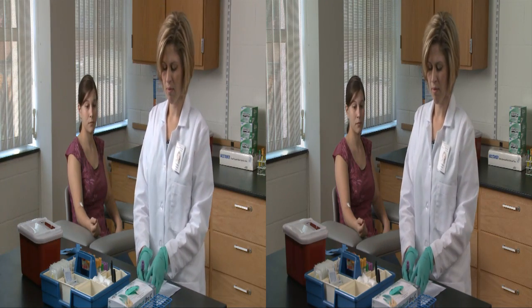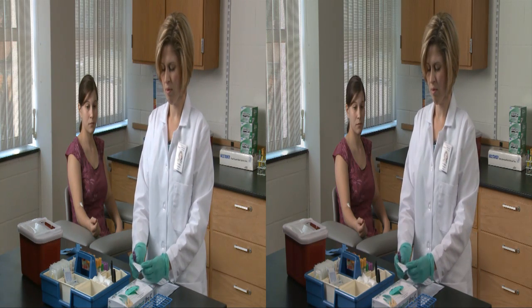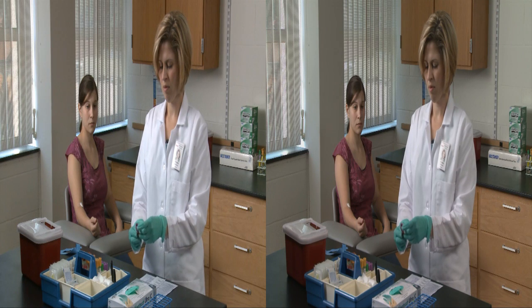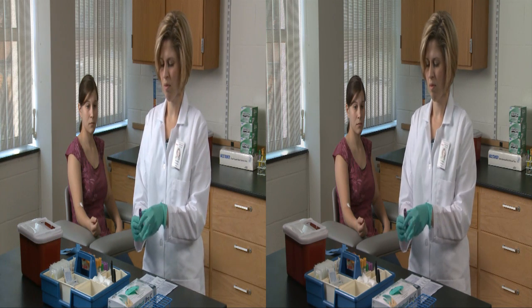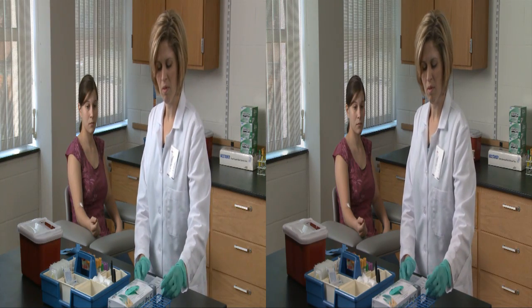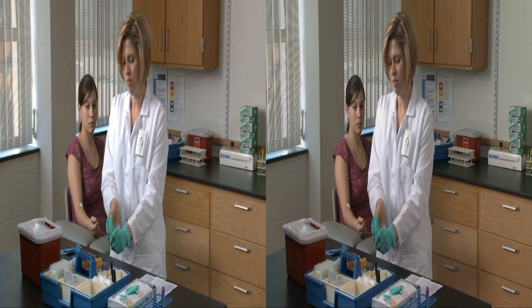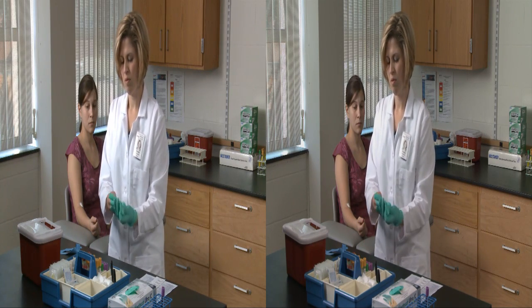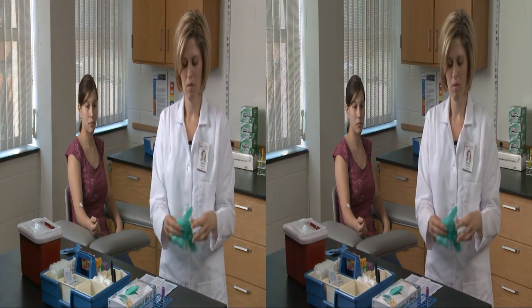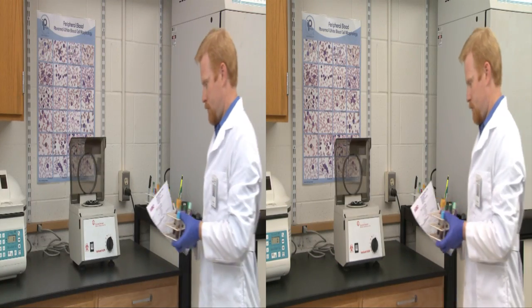Apply the ID label on the filled evacuation tube and store it for transport to the lab. The label must include at least the patient's ID number, full name, date of birth, and today's date. Using standard precautions, dispose of needles in a sharps container. Dispose of all other used non-sharp materials, including used gloves and gauze pads, in an approved trash receptacle. And disinfect all contaminated surface areas. You've just completed a successful blood draw, providing a sample that can be processed for analysis.